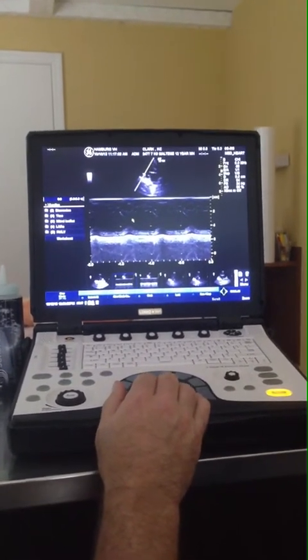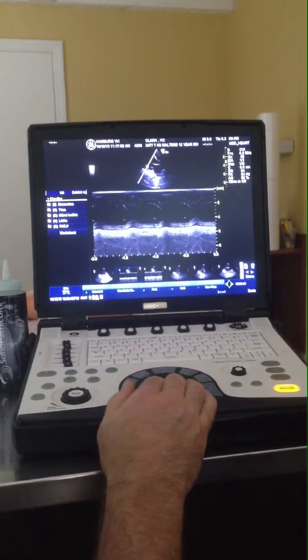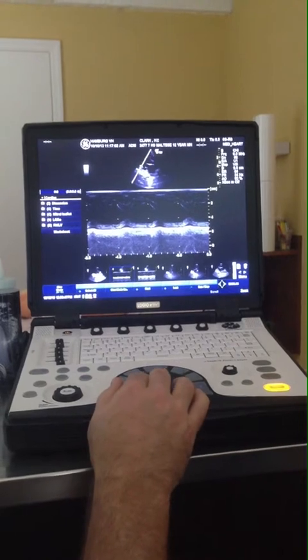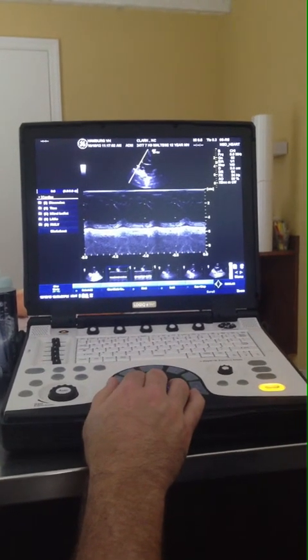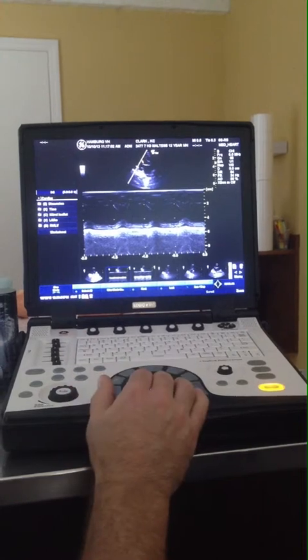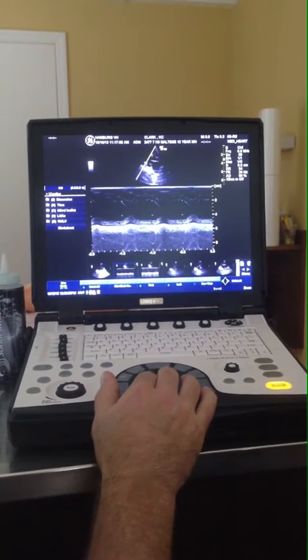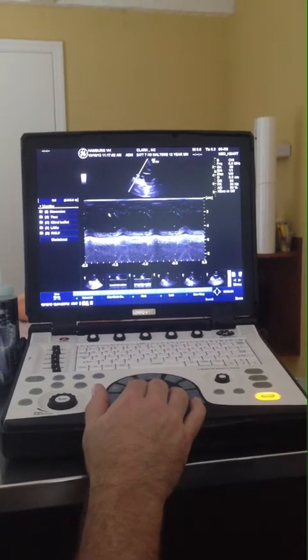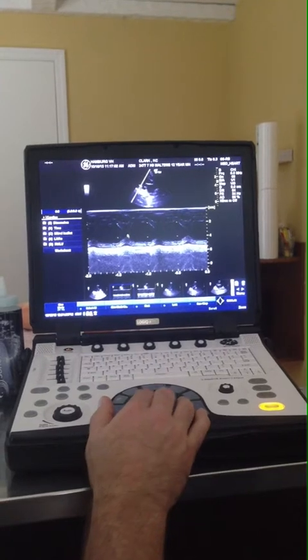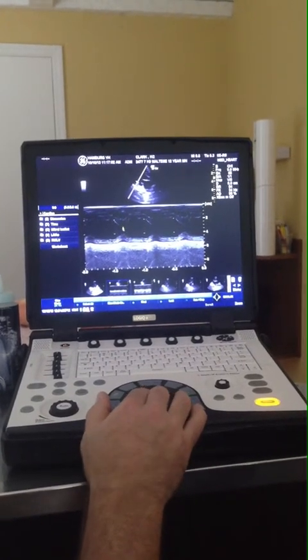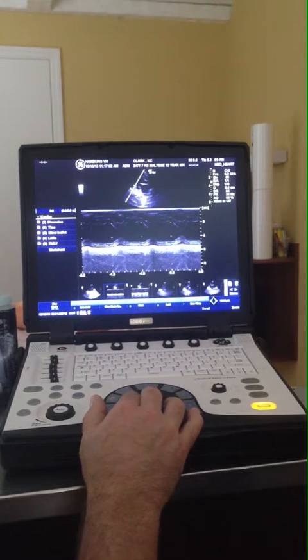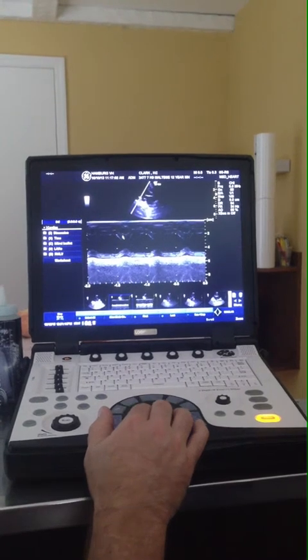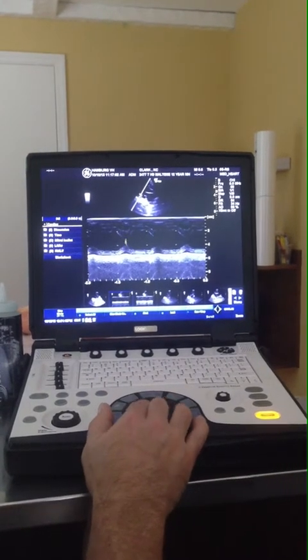Here we save the M-mode, and we know it's in correct position because the cursor is perpendicular to the septum and perpendicular to the free wall. Even though the left ventricle is enlarged, the left atrium is enlarged, and the dog was rotated because of this volume overload, we adapted to make sure the cursor went perpendicular to the septum and free wall. We can see that's the case because the systolic contraction of the septum is equal and lined up correctly with the free wall systolic contraction. If we're offline, this will contract here and this will contract here, and they won't be in the same spot.